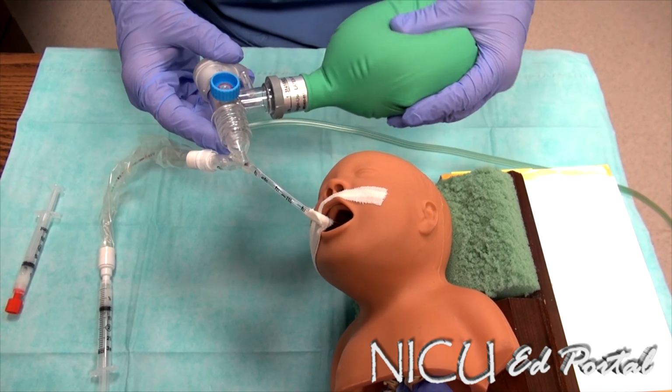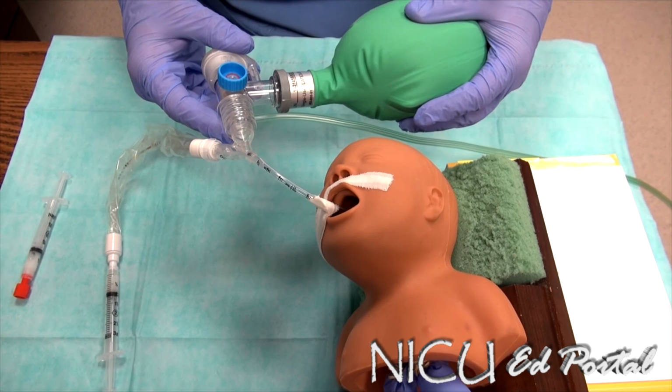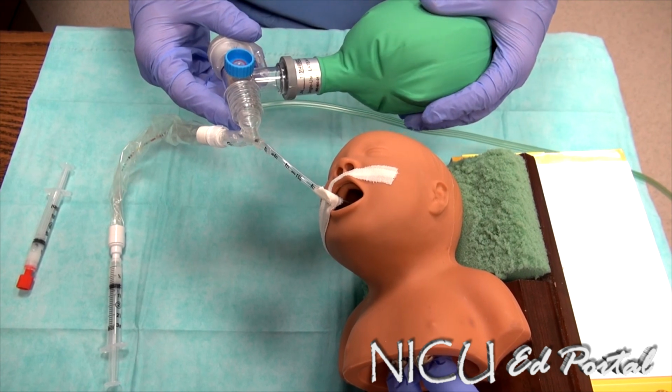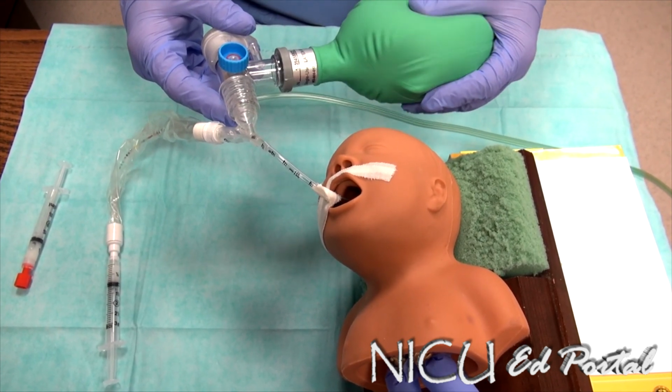Things to consider: while surfactant is being administered, like I said, watch the vital signs, and also after administration, try to wait minimally 1 hour.